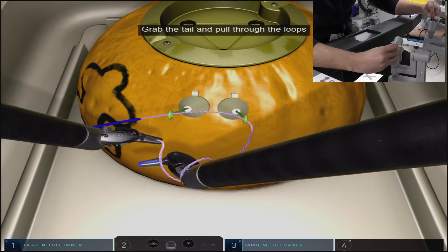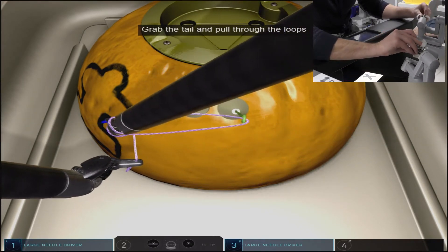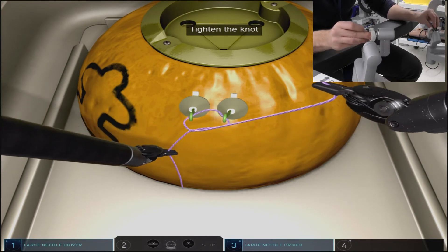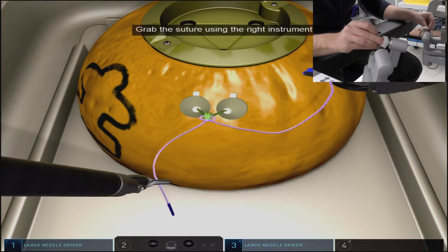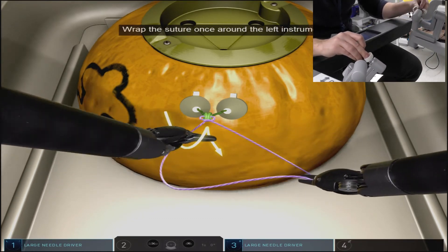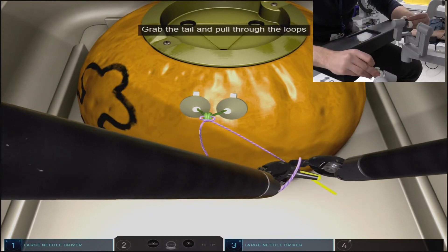Try and grab a more distal portion of the tie with the right arm as you go to pull through your knot. When tightening down your knot you'll need to re-grab in order to prevent going off screen. We found the best way to do this in this exercise is to actually pull up on one end of the ties as you tighten down your knot.